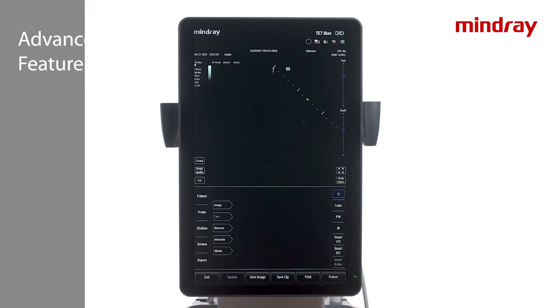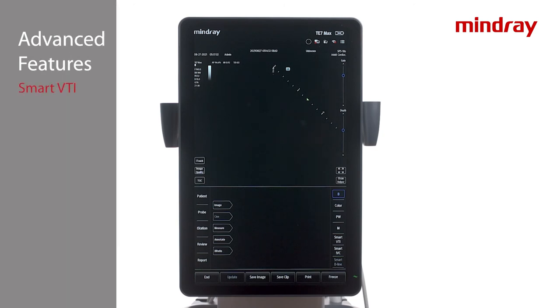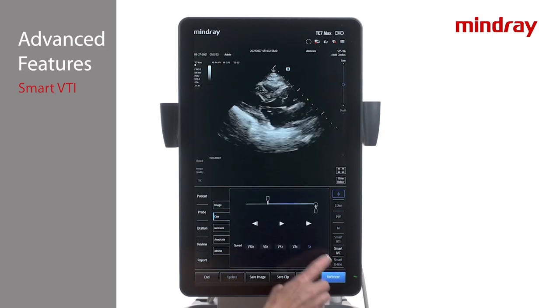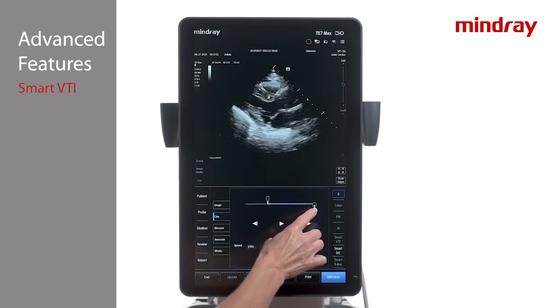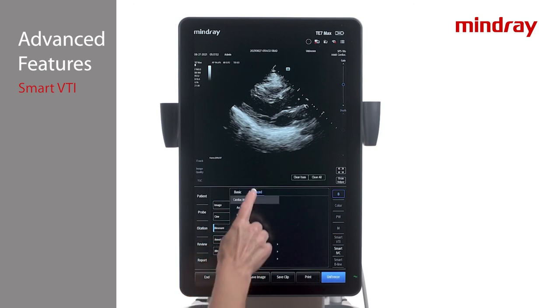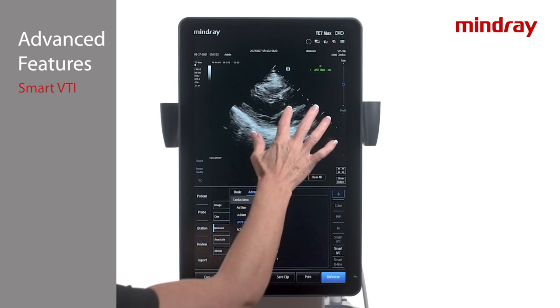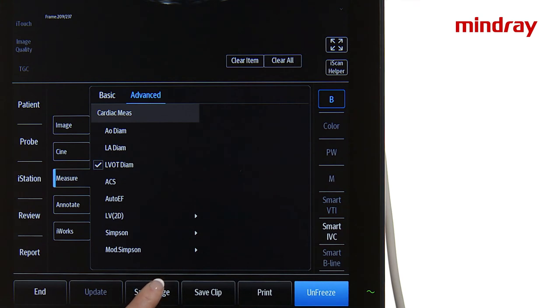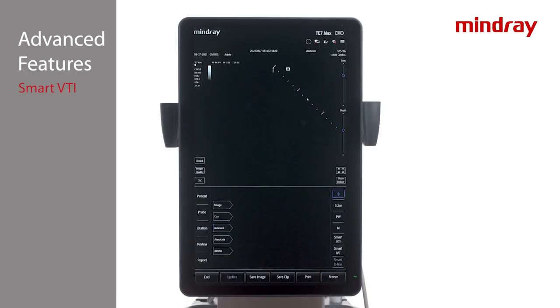The Smart VTI tool provides quick analysis of a patient's stroke volume and cardiac output. Smart VTI is done while live scanning and cannot be applied to a previously stored clip. Begin with the phased array transducer in a cardiac or FAST exam mode and measure the LVOT diameter. To measure, obtain a parasternal long axis view and press freeze. Scroll to end systole, tap Measure Advanced LVOT Diameter, and place the calipers to measure the outflow tract.